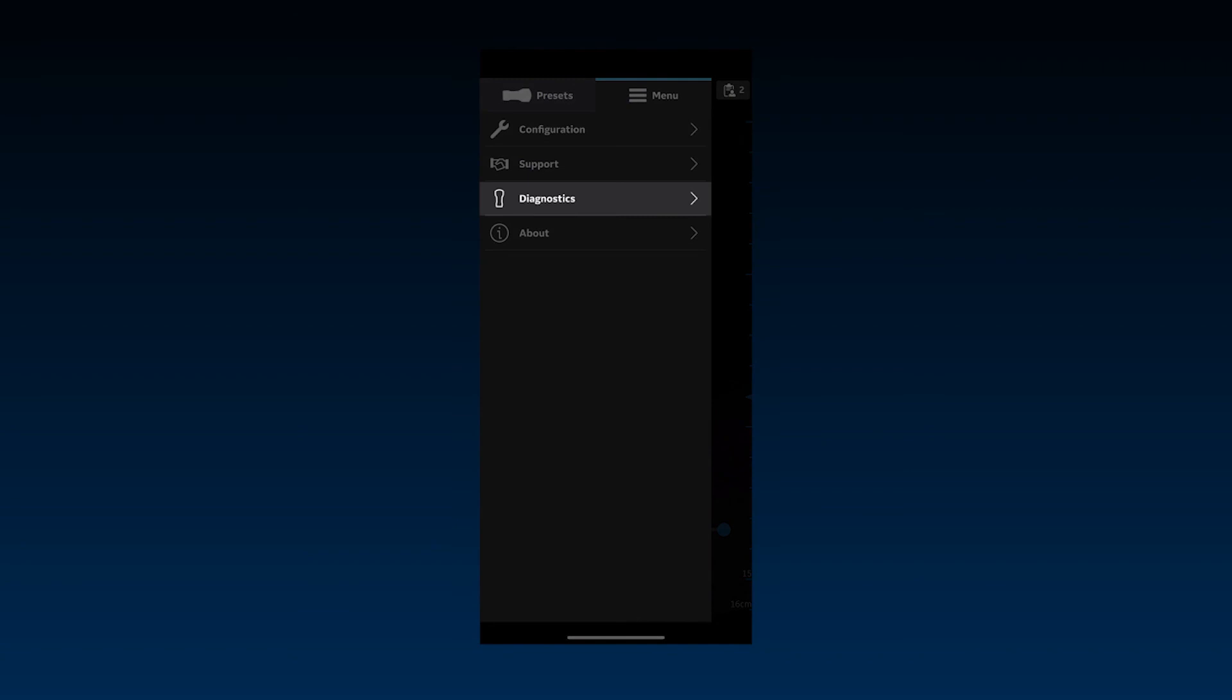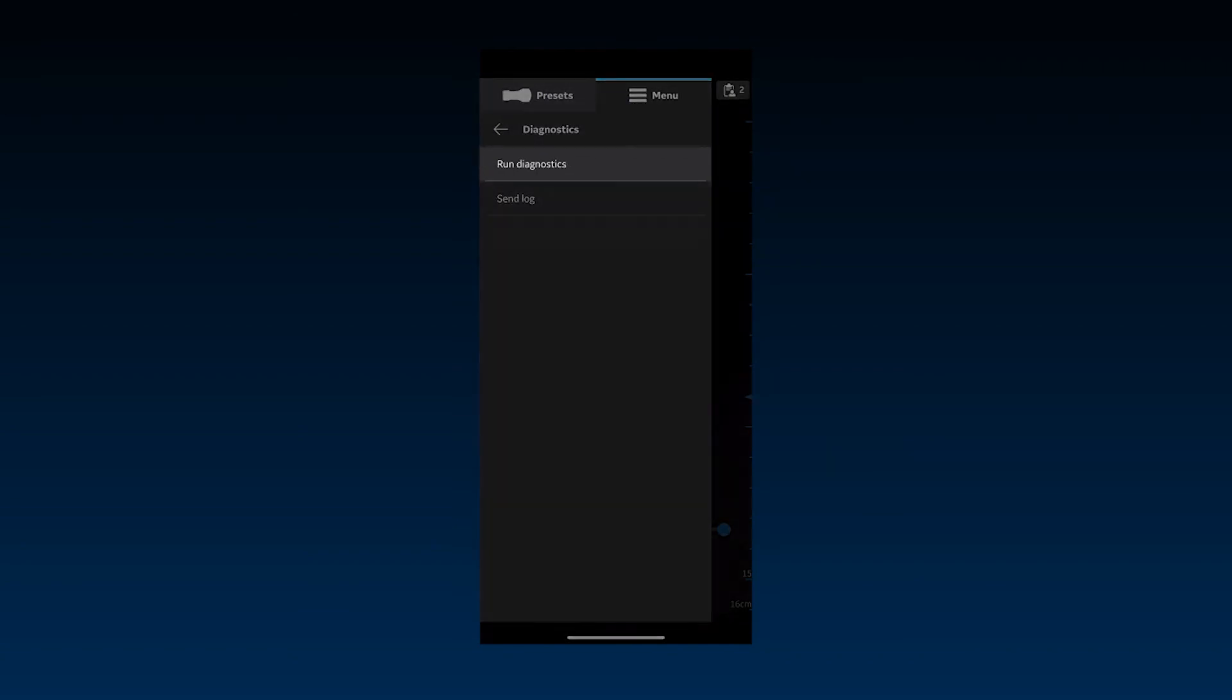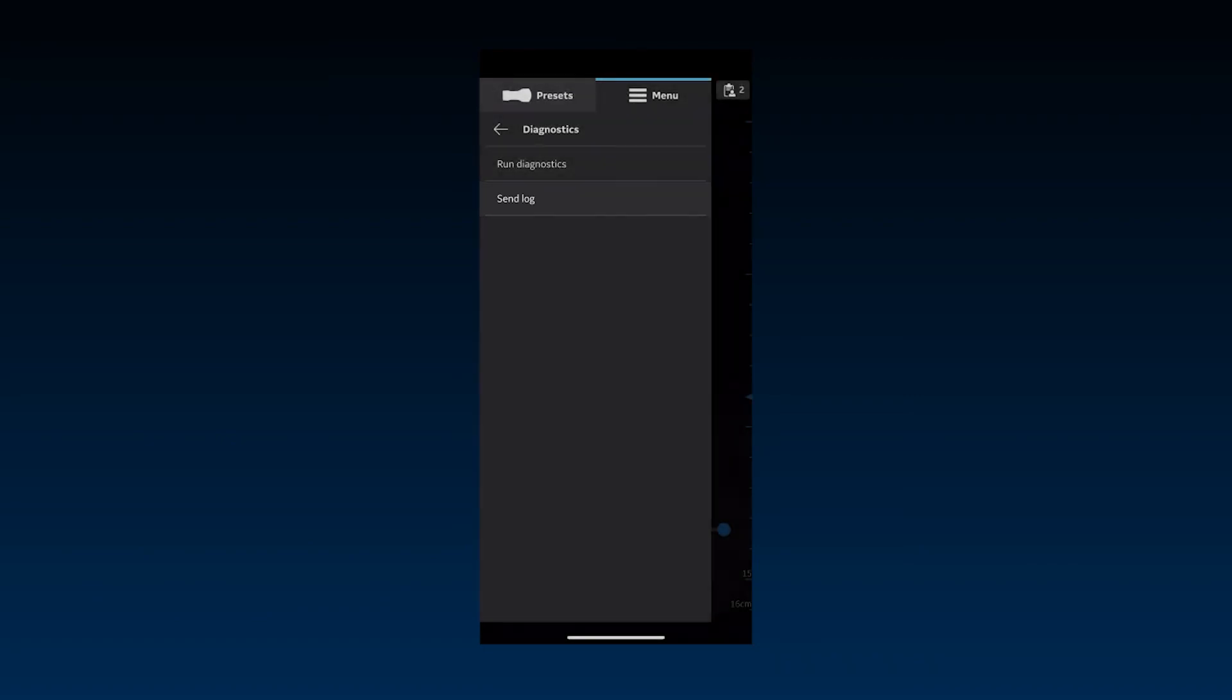The Diagnostics option allows you to run functional tests on the vScan Air and send system logs to GE Healthcare for more detailed remote analysis.